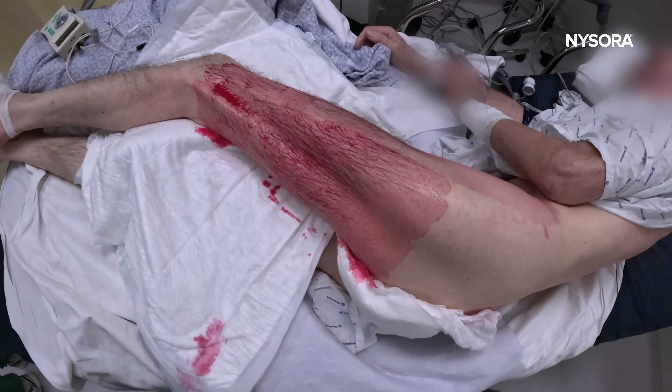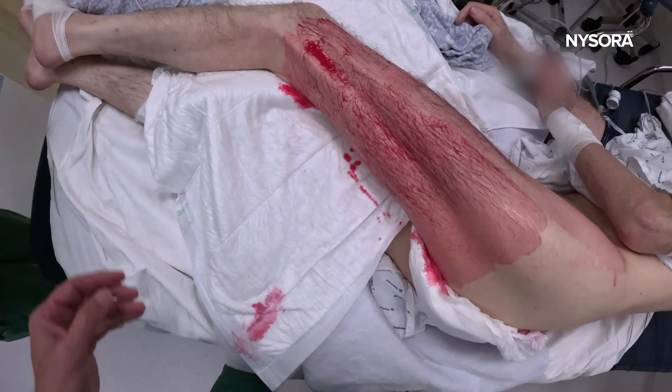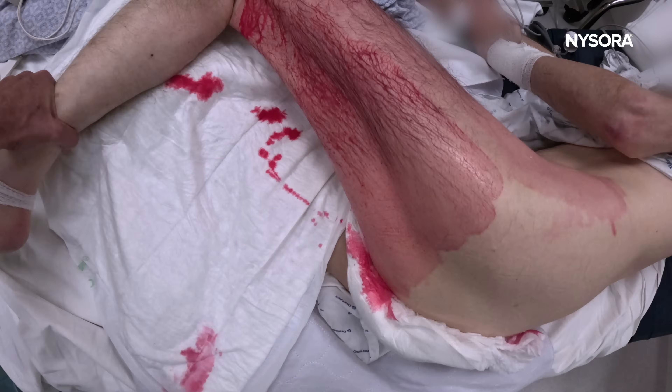Here is the proper positioning — the patient in the oblique position. Even better yet, you can bend the leg like this to improve access for the subgluteal sciatic block.